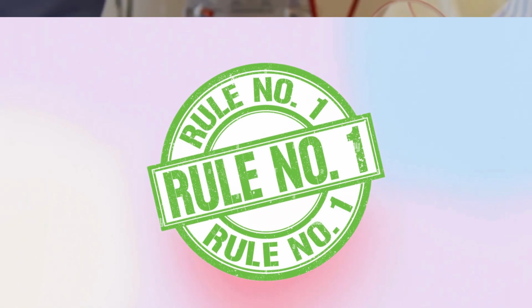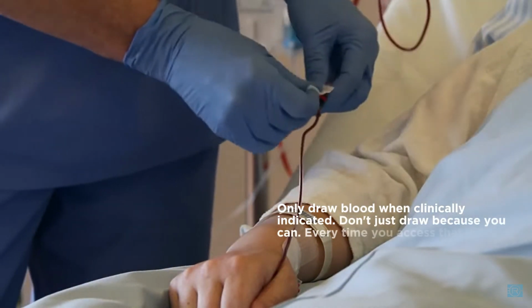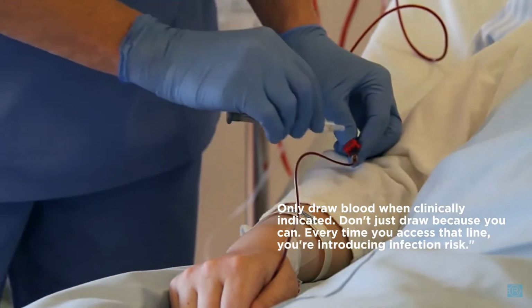Let's talk about drawing blood from arterial lines, because this is where contamination happens, and contaminated samples lead to wrong diagnosis and wrong treatments. First rule: only draw blood when clinically indicated. Don't just draw because you can. Every time you access that line, you're introducing infection risk.